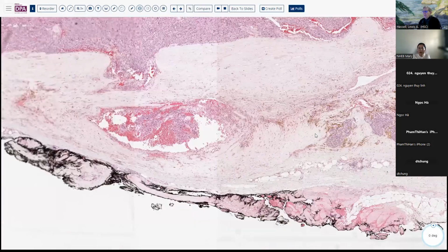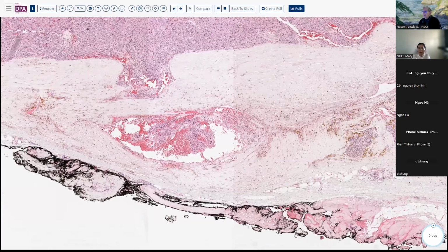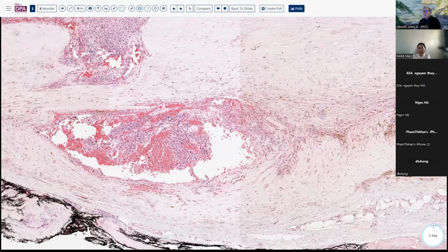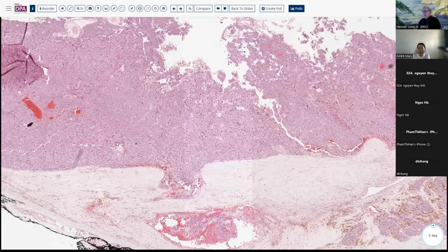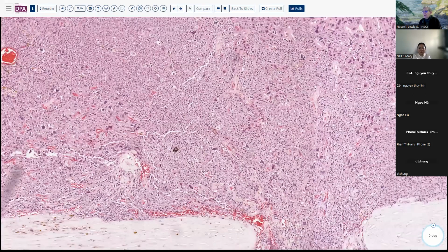And we had this area here where we have penetration, and here an area of likely vascular invasion by this neoplasm. So several of the criteria are met there. Again, we do have some cellular pleomorphism, but as we've seen, that's not a highly reliable predictor.